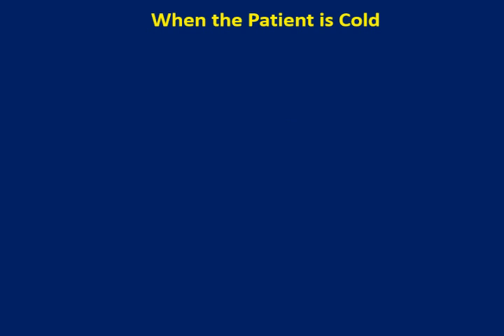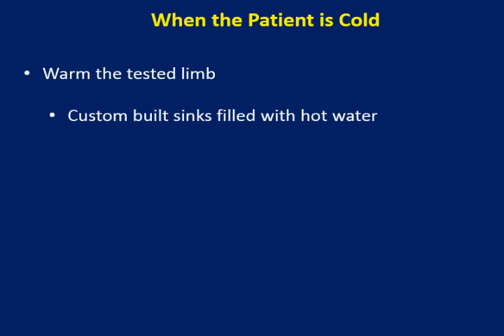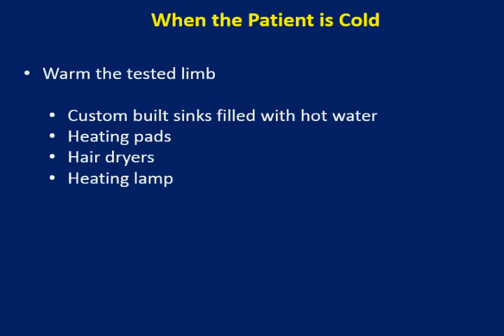When the patient is cold, there are two options. The first one is to warm the tested limb. This is done in a variety of ways. Some laboratories have custom sinks that can be filled with hot water to warm hands and feet. Other laboratories use heating pads used in physical therapy. Hair dryer and heating lamps, etc.